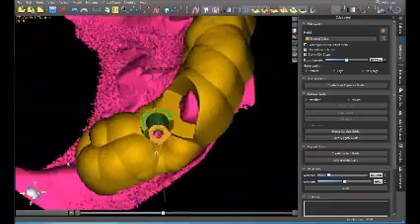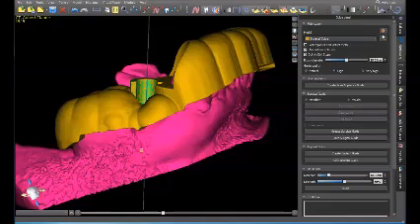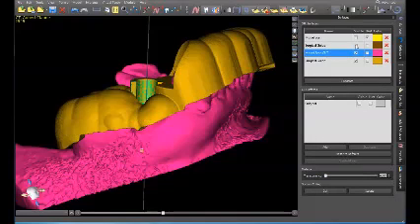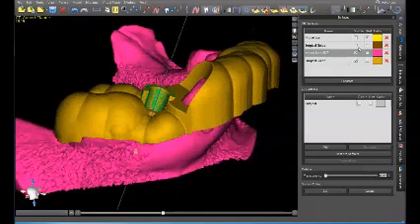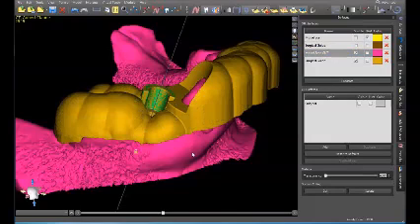So this is what that guide looks like as compared to, let's turn back on this guide, something like this. A little bit more visual, I guess. You can see a little bit more of the buccal as opposed to this brown guide. Some people might like that. So basically just cutting this away.